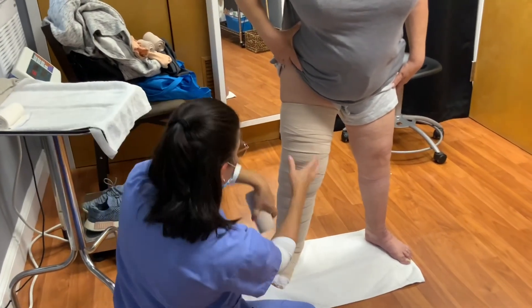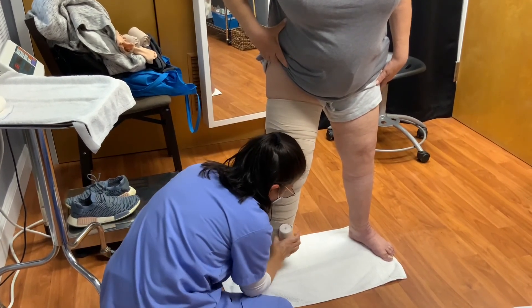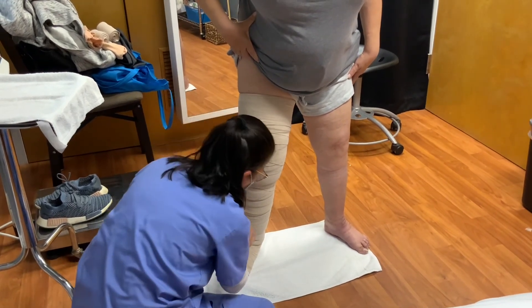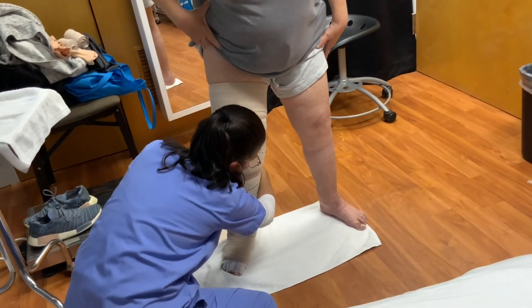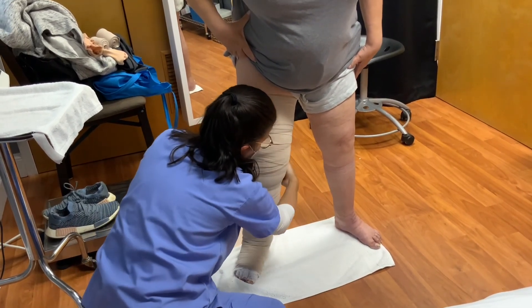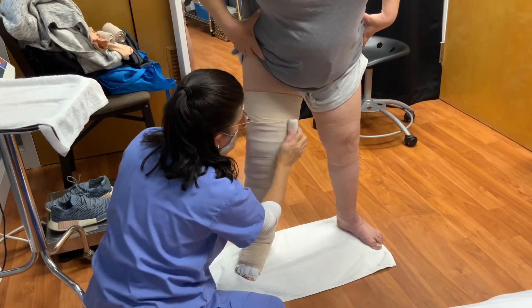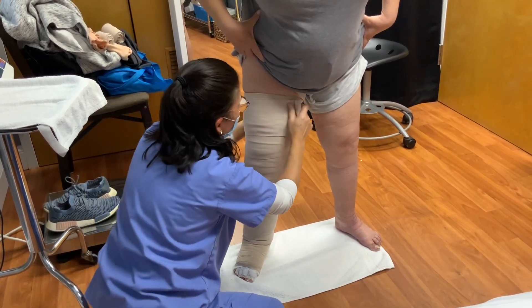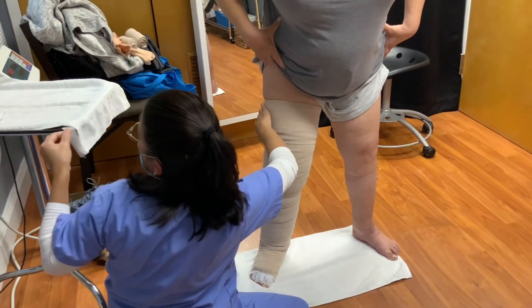I always like to finish when I do a whole leg with the 12 centimeters. Start it at the bottom, contain it all, going up. This is really just to help contain everything in place, all the way to the top. With someone much taller, you would probably need more bandages. This worked perfectly for my patient.